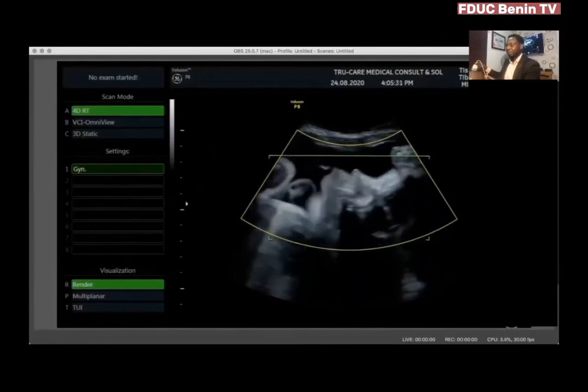And I'm going to try to just increase the volume of acquisition and then go ahead to try to get it. So again, if I check the image here, you would see that I'm reducing the gain. We can see part of the face, but it's not as clear as I want it to be, because there's possibly some interference. I'm going to go out.